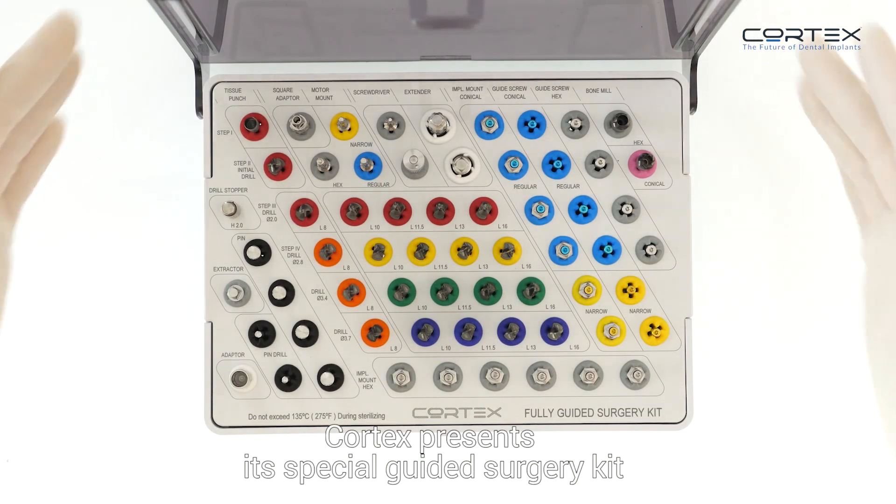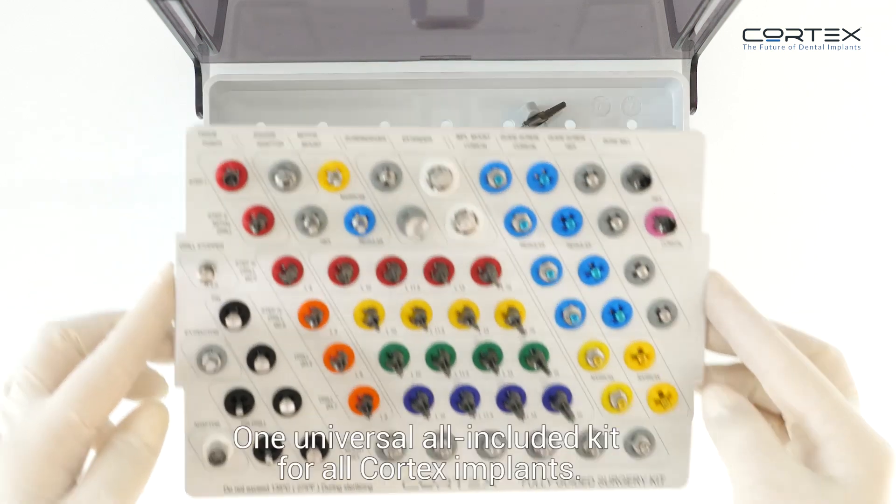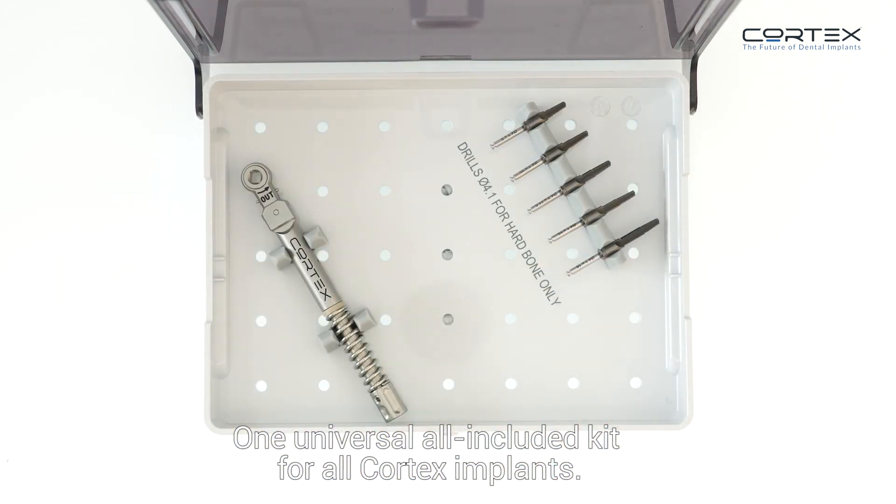Cortex presents its special guided surgery kit — one universal, all-included kit for all Cortex implants.